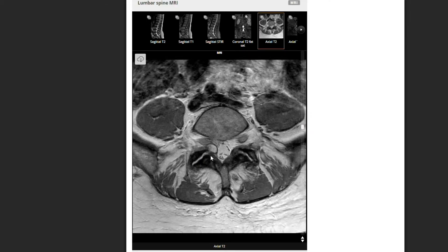Facet hypertrophy really means growth of a facet joint, and we have two facet joints per level — one here and one here. Notice inside the joint we have rough, wavy edges. Those rough edges aren't the same; this side looks like it's a little more rough than this side, versus over here it's a little bit blurry.